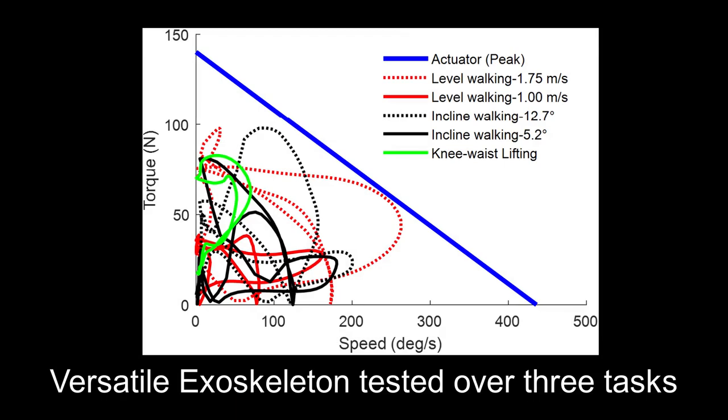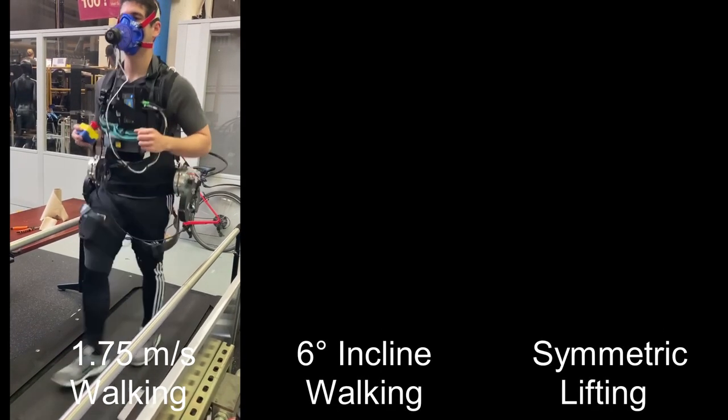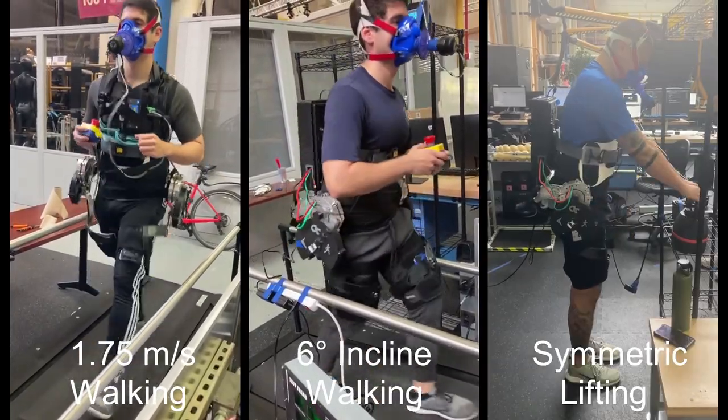With benchtop and human torque tracking testing complete, we proceed to demonstrate the versatility of the exoskeleton over three tasks. These tasks include high-speed walking at 1.75 meters per second, incline walking at 6 degrees, and symmetric knee-to-waist lifting.